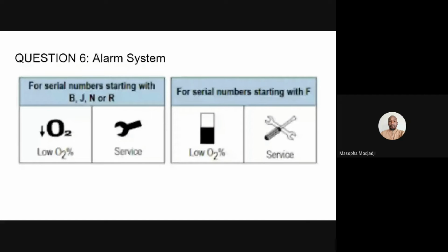The alarm system is incorporated on the printed circuit board and is connected to a microcontroller on the PCB, which is responsible for sending out different error messages depending on what is being read from the sensor. The sensor detects changes in the system and sends the data to the microcontroller, which in turn commands the buzzer to sound or not, depending on the change.